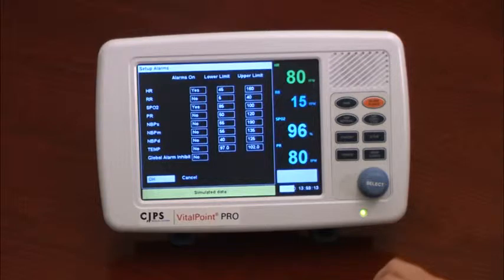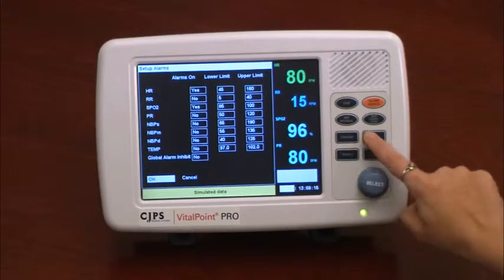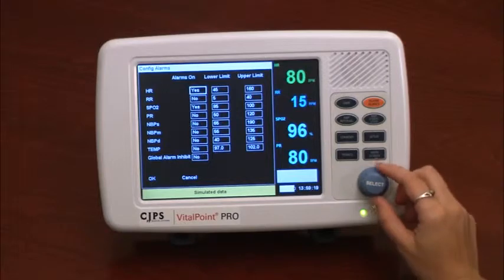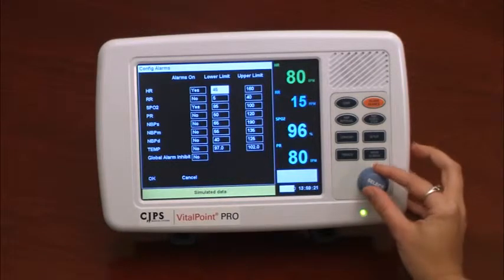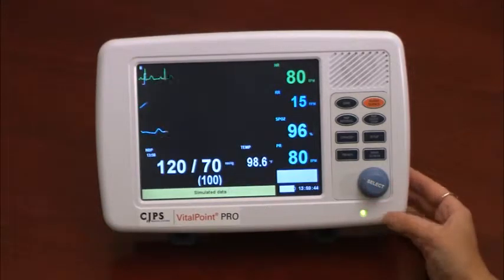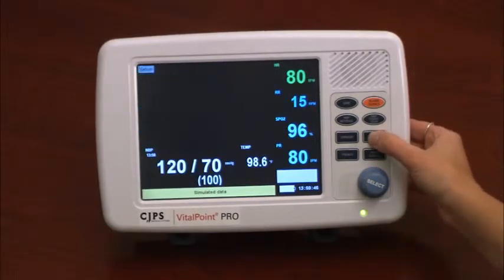for the patient. The alarms are based on parameter settings for each vital sign measure, and if a reading falls outside the set range, it will trigger an alarm. For quick access to the editing function of the alarms, the user can simply press Trends, followed by Setup on the keypad. This shortcut function then allows the user to change the parameter and alarm settings directly from the Alarms window. The next option in the Setup menu is Waveforms.